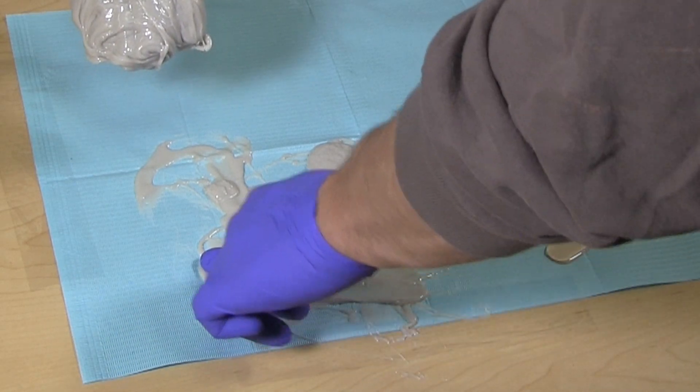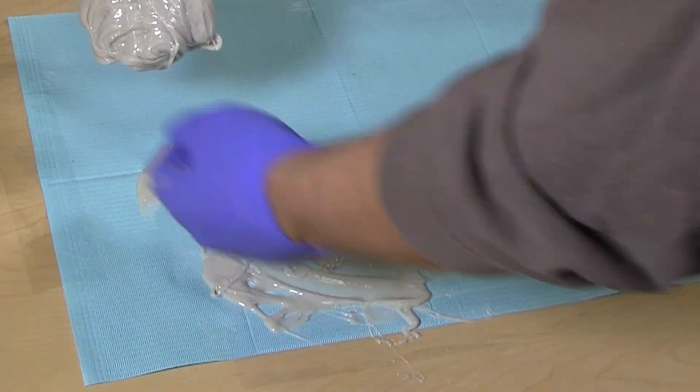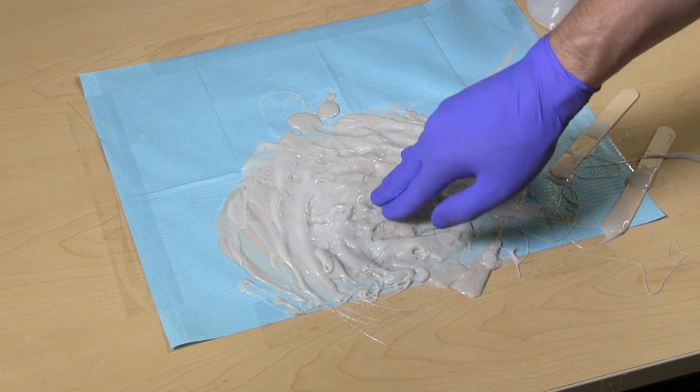When excess material on the work mat is cured, the impression is ready to be removed from the customer. If the material is tacky to the touch, wait a few more minutes.